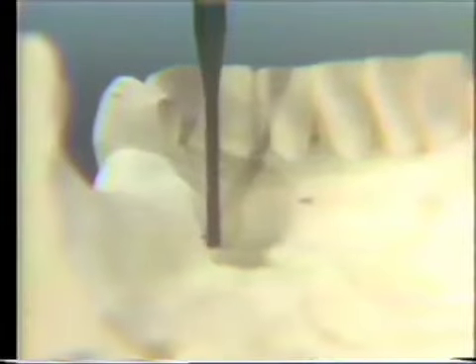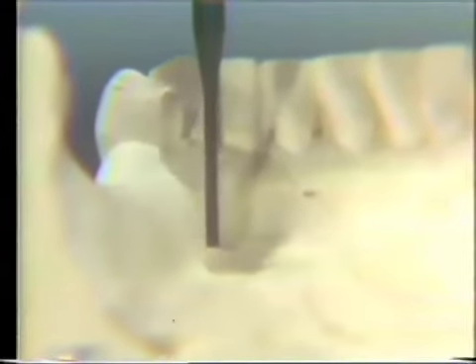There is no undercut in the anterior or the posterior in the soft tissue areas. We're in contact right near the fold of the floor of the mouth, where the floor of the mouth meets the residual ridge. That is the greatest diameter of the ridge. So we have no undercuts to contend with on the residual ridge, on the lingual surface.